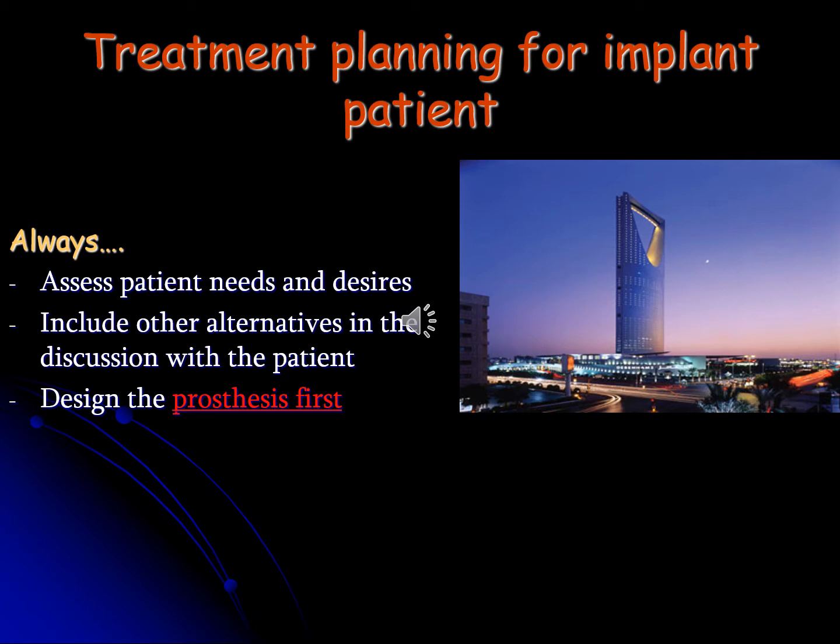We should always design the prosthesis first. This is a very important note. We should always design the prosthesis first. Okay? I will give you my statement: design the prosthesis first. Start from the end. What is the end? The end is the prosthesis. We should design the prosthesis first.